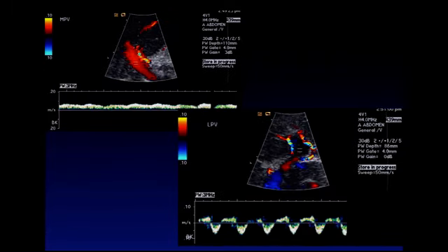Really, the answer is shown when you do the pulse Doppler, and when we look, there is normal pulsatile flow in the main portal vein, but the left portal vein is actually biphasic, and there is transient reversal and antegrade flow. So this again is that early manifestation of portal hypertension seeming to manifest itself first in the left portal vein. So we made the diagnosis of sinusoidal obstruction syndrome, and this was confirmed with a subsequent wedged hepatic venous pressure tracings.